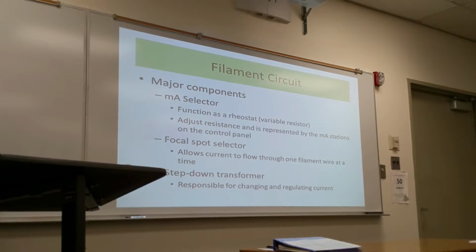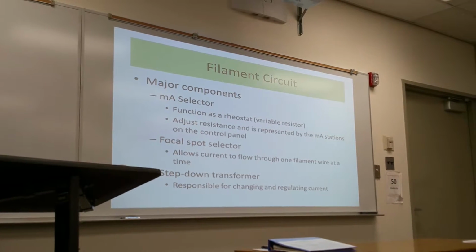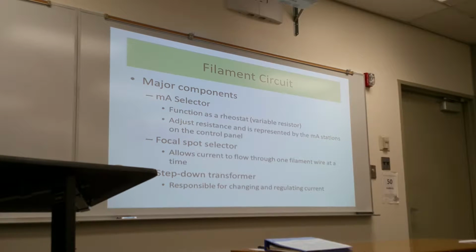And of course, the filament circuit has a step-down transformer, which is responsible for changing and regulating current based on, again, your MA selection.